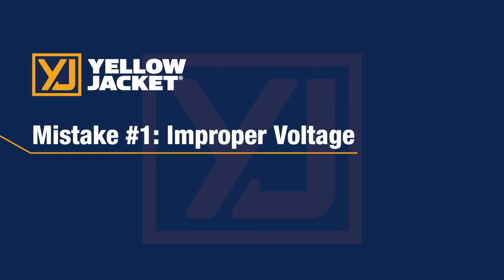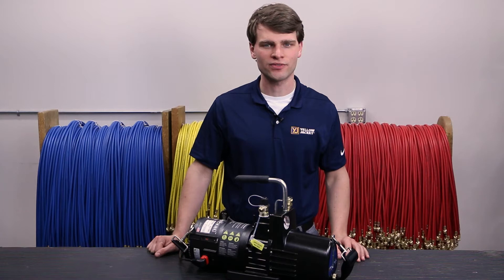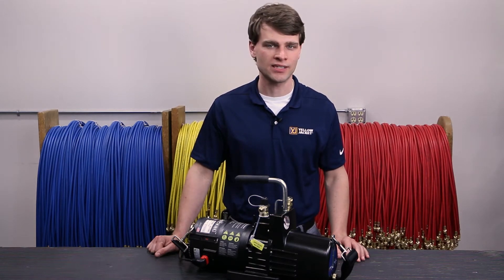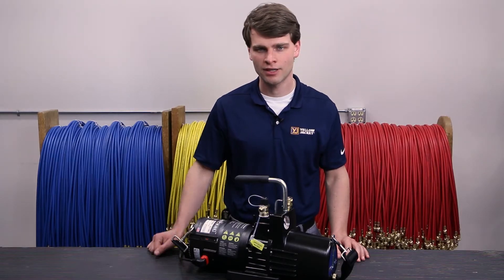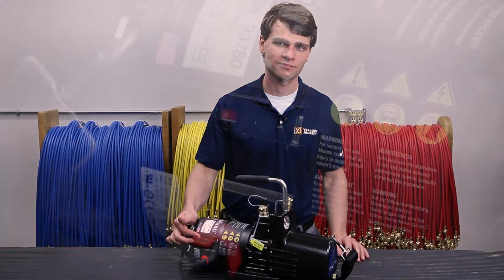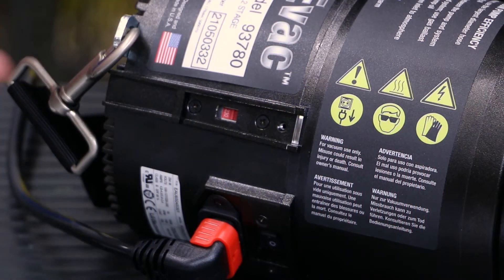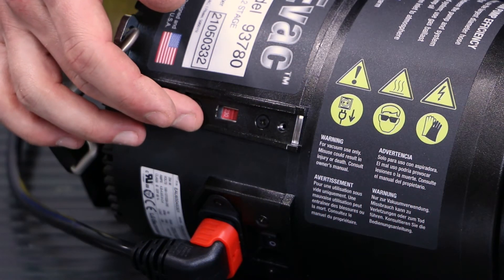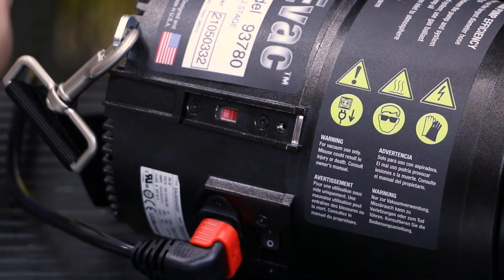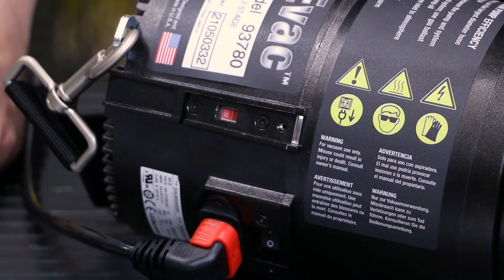Now let's review some common mistakes. The first mistake you may find is if the voltage switch is set to the wrong setting. The SuperEvac Plus II features a universal motor designed to work with both 115 and 230 volts AC at either 50 or 60 hertz. If the motor is set to the wrong setting, it may not start properly. Here we have a pump with the voltage set to 230 volts AC but on a 115 volt input. When the switch is flipped, it may start under ideal conditions but will quickly stall out since it doesn't have the power for the loads of pumping down a system.